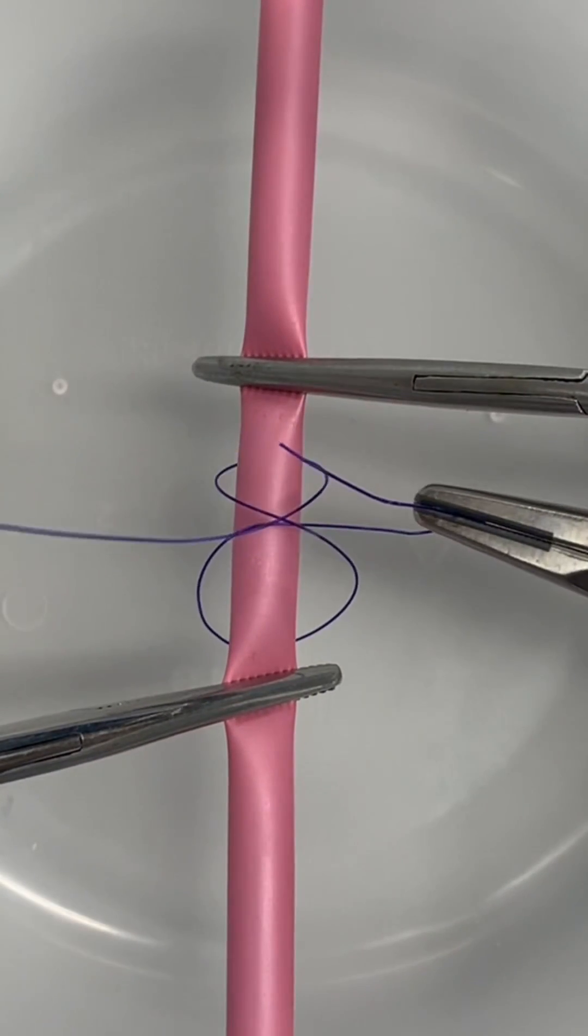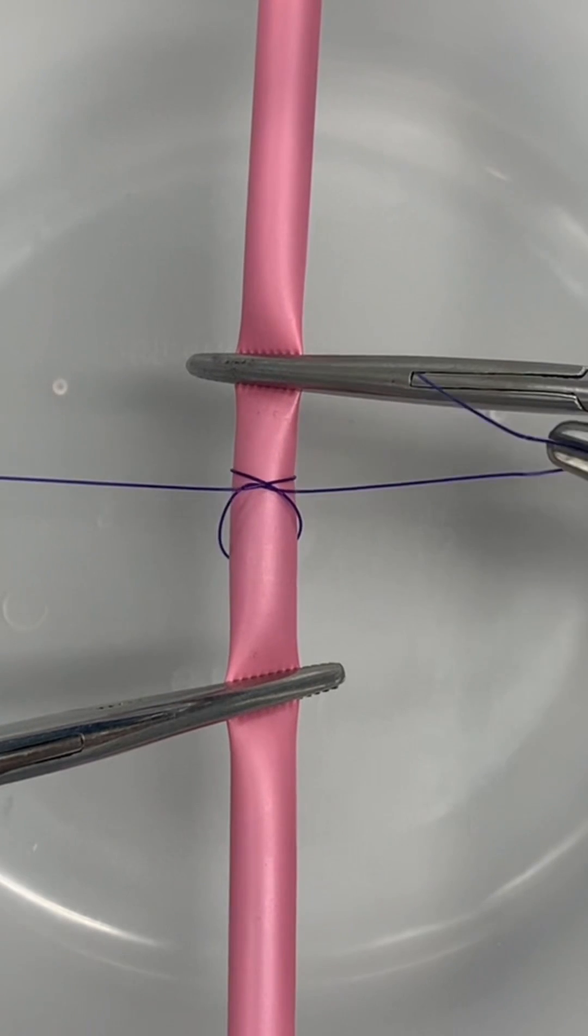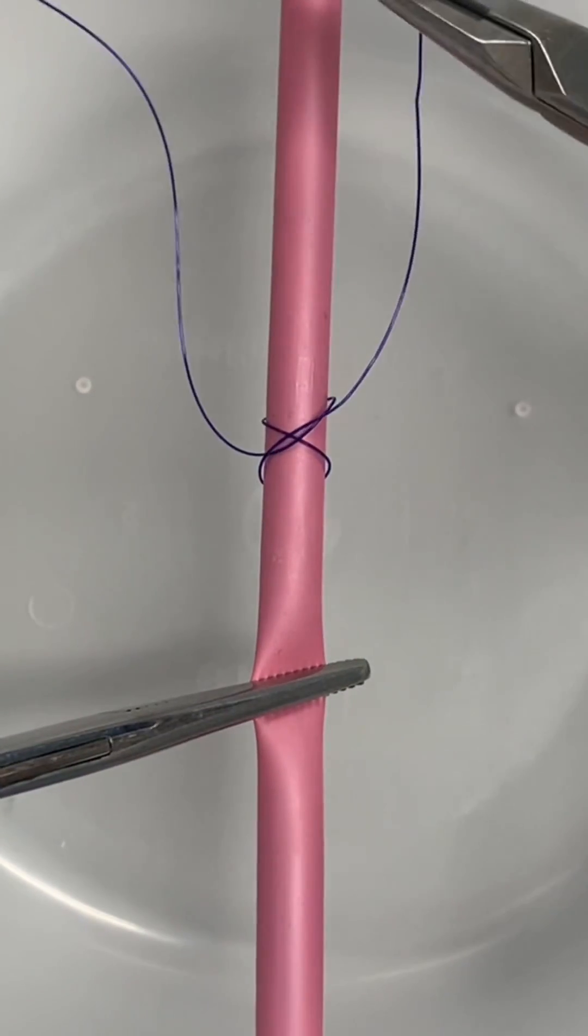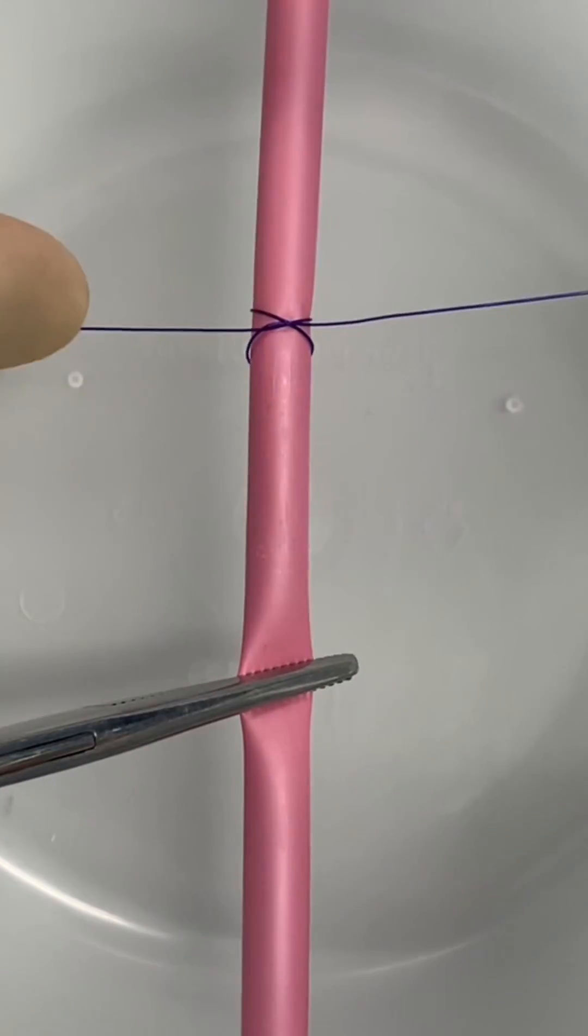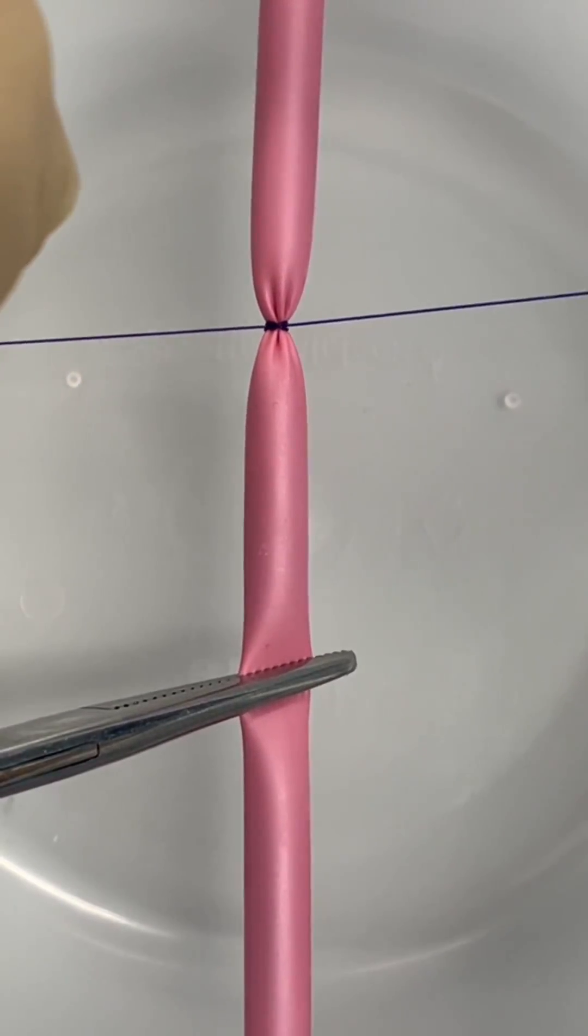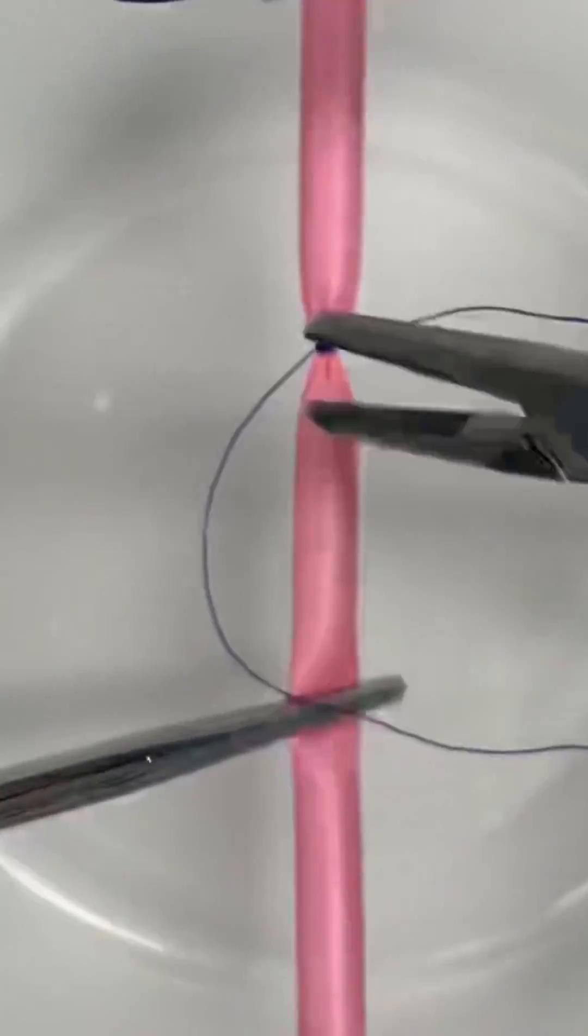Now you already have the constrictor knot, but don't tighten it just yet. Remove the more proximal clamp and slide the knot into the crush mark created by the clamp. Once it's in place, pull both ends equally to tighten and reinforce it with some square knots.